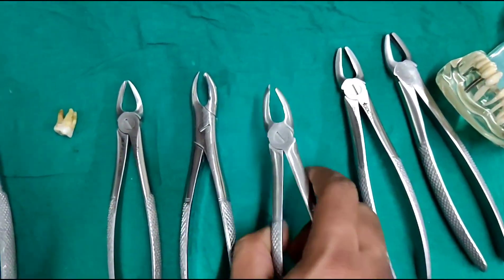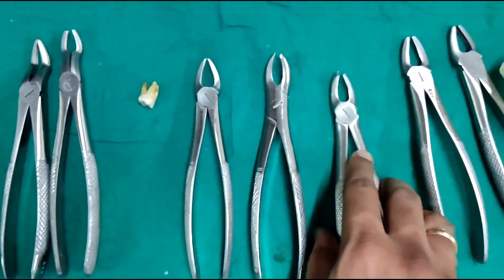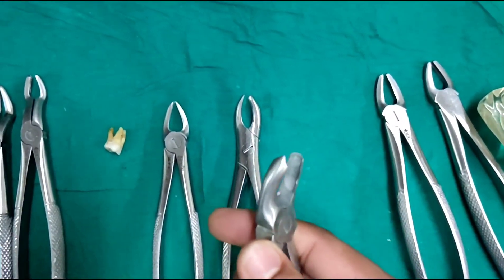This is also a molar forceps of the first quadrant, but here the buccal beak is not in the form of a cow horn — it is in the shape of a typical molar forceps beak.